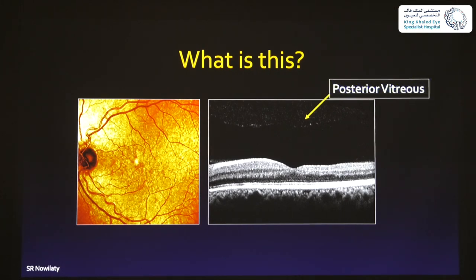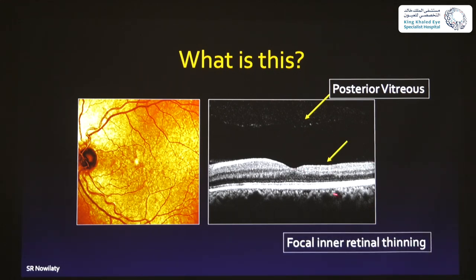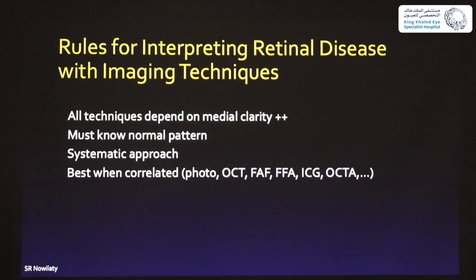The posterior vitreous and the premacular bursa: the premacular bursa is a pocket of clear fluid right in front of the macula before the vitreous detaches completely. Here the vitreous goes up on both sides and you have this bag of fluid — once this fluid goes through the posterior hyaloid, it will lift the vitreous up. Thinning on one side compared to the other is visible — the thicker side with a thicker nerve fiber layer is nasal. If the retina appears thin on the other side, it's probably due to a vascular insult.